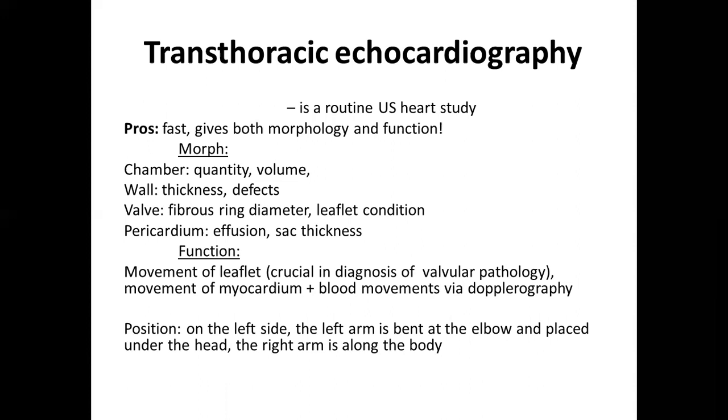We can evaluate walls, like myocardial walls. We can understand how thick they are. If your patient has some dystrophia or arrhythmias, you may see thinning of the wall of the heart.